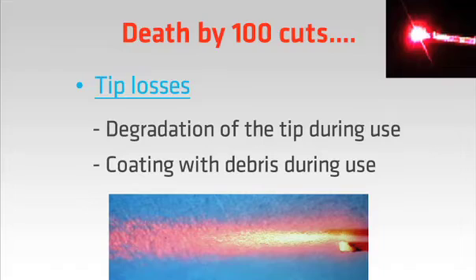As we are using the tip during surgery, its performance becomes affected by heat-induced degradation. This is why the tips are designed as disposable items for single procedure use. A damaged tip will show a bizarre pattern from the red aiming beam. During contact procedures like surgery and perio-disinfection, sticky strands of tissue will coat onto the sides of the tip and onto the end. This material needs to be wiped off so the emission of laser energy is not affected. At the end of the procedure, just throw the tips away. Don't try to steam sterilize them or they'll just melt.